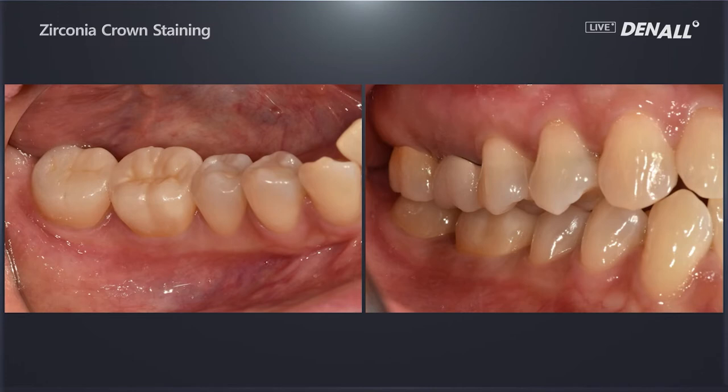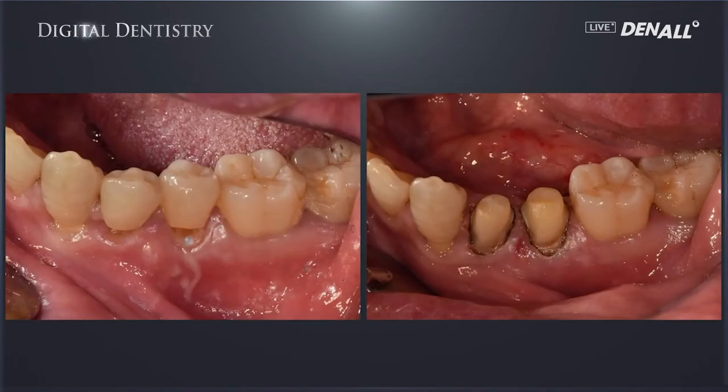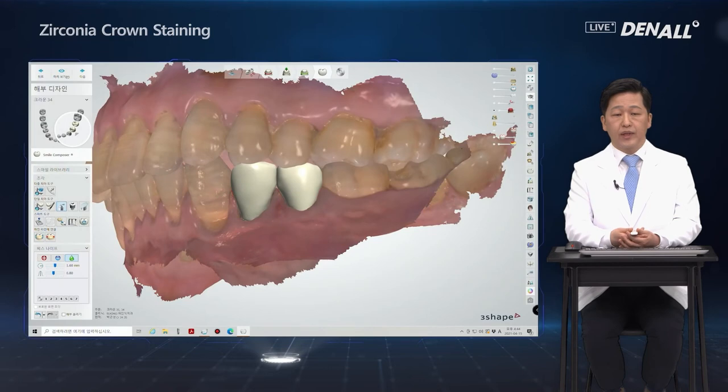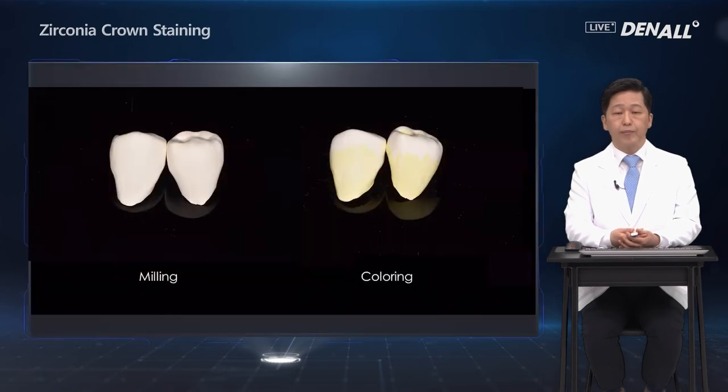The staining process is completed. I do the staining usually on the buccal surface and the grooves on the cusp. The cusp and lingual surface is polished, so the crown is finally completed and delivered in the mouth. Using staining, the aesthetic effect is achieved — the color is similar to the adjacent teeth. If you look at this case, the patient has a unique color of teeth with a striped band that cannot be made with the usual coloring technique. So, using the dental system, it is designed, milled, and the basic color is made using coloring. Let's look at a video of the staining process.